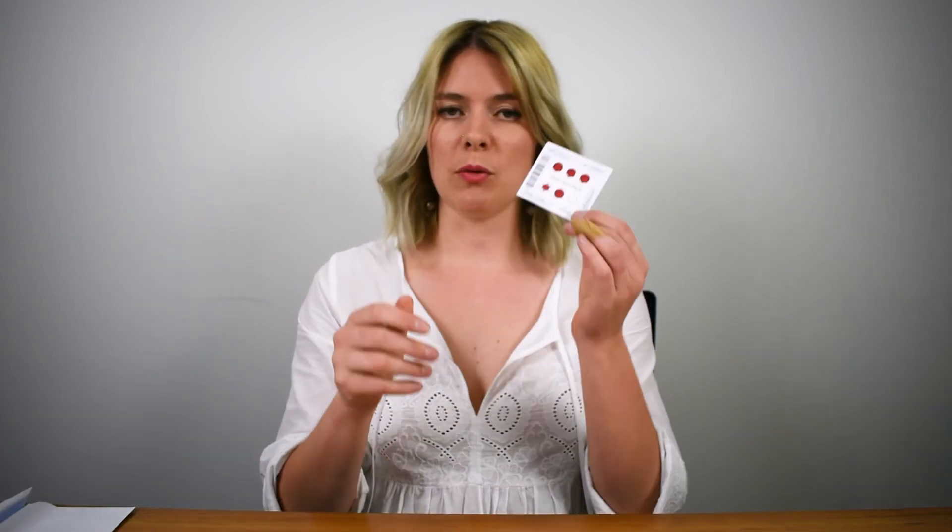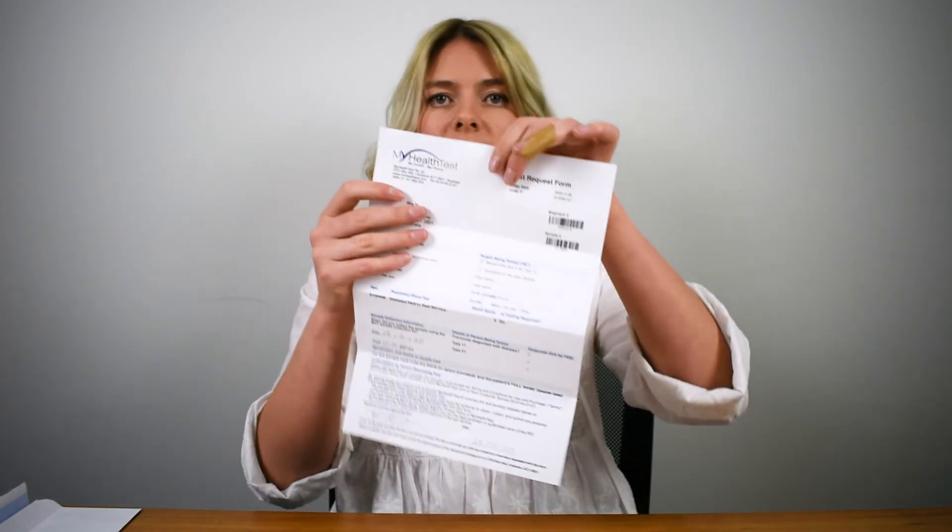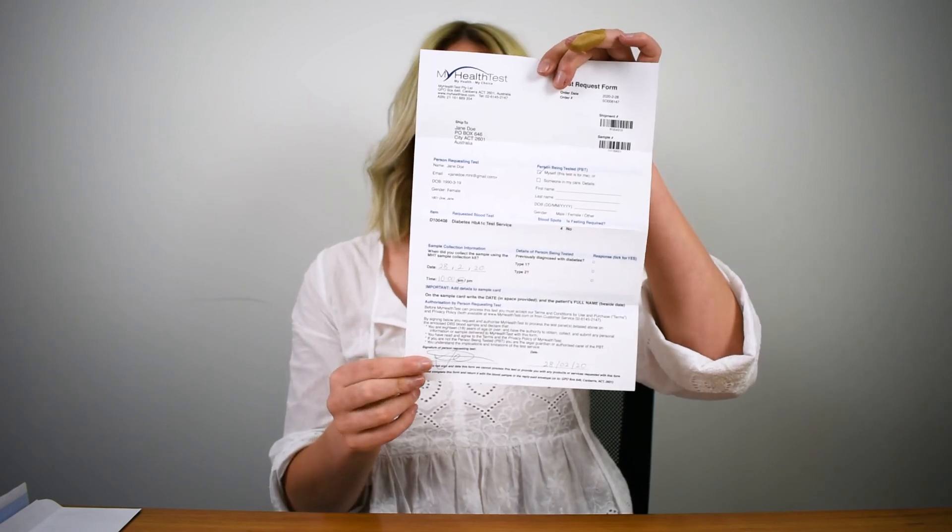Once you've completed the test and have the required number of circles, put your sample collection card into the small card envelope. Place this inside your reply paid envelope. Then do a final check on your test request form to make sure everything is filled out correctly, paying special attention to the signature at the bottom — that's what gives us authorization to process the sample. Place that into the reply paid postage envelope, seal it up, and post it in any Australia Post box within 24 hours.